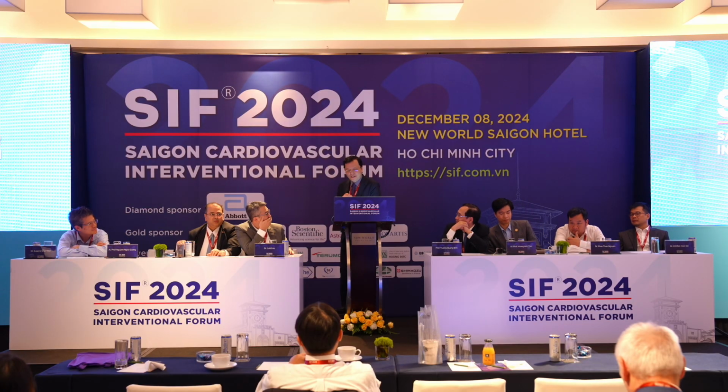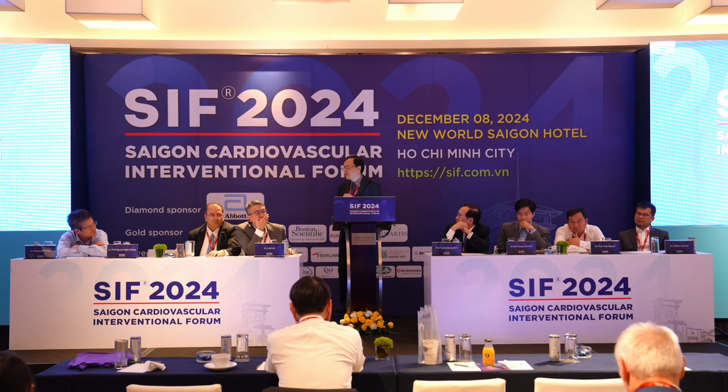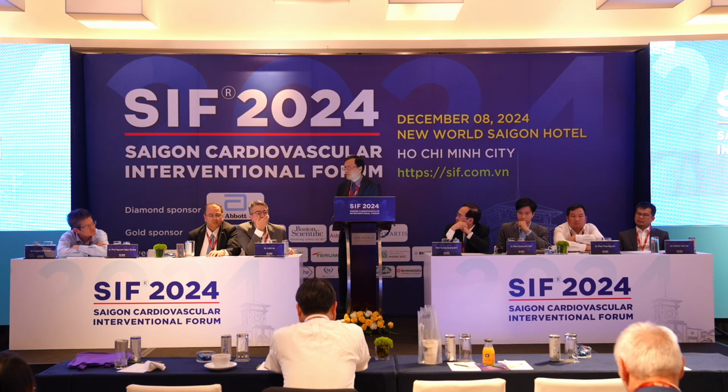Yeah, that is a very interesting question. If we cannot remove the burr, maybe we have to puncture the other side femoral, and we use a wire and balloon with the ping pong technique to open the proximal part and even the burr to take the burr out. And if we cannot remove the burr, maybe we have to cut the burr, and we use mother and child, with deep intubation of the mother and child, to remove the burr.